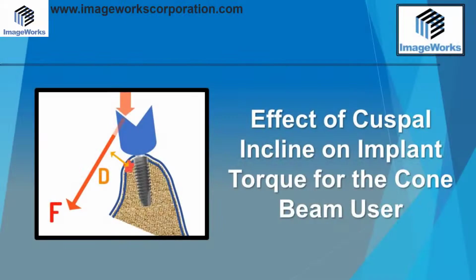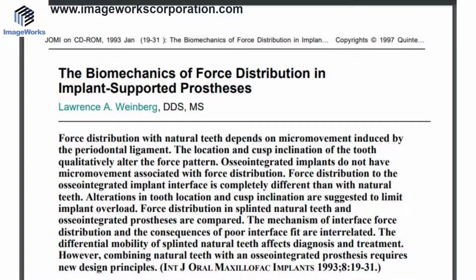As our dental cone beam customers grow their practices with implant treatment, we have found that some doctors have valued a refresher on some of the mechanical concepts that may play a role in their implant design. In this short video, we're going to review some concepts from a paper written by Dr. Lawrence Weinberg that discusses, among other things, how cuspal inclination can affect the torque in an implant design.